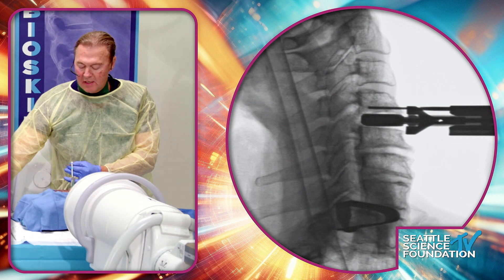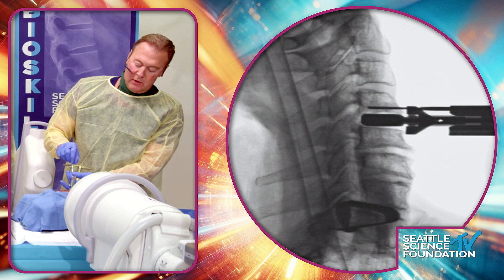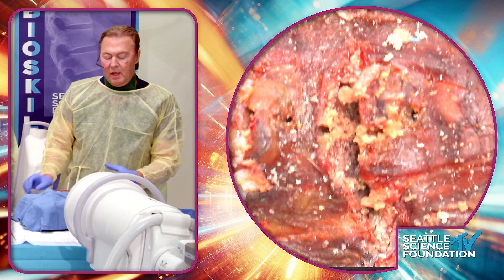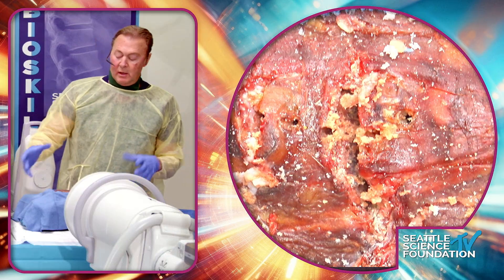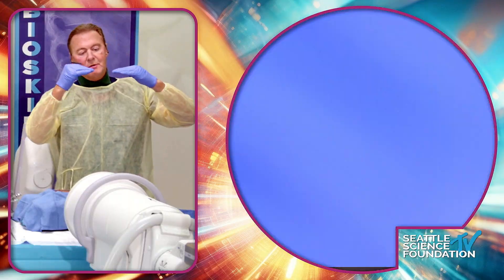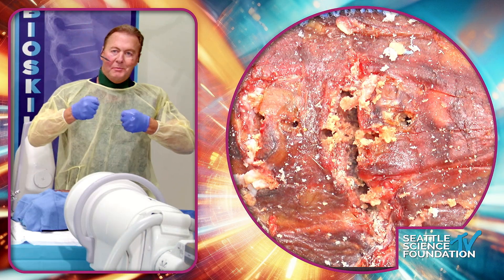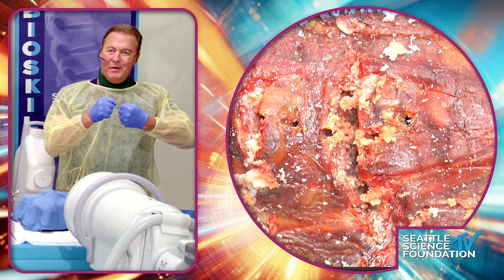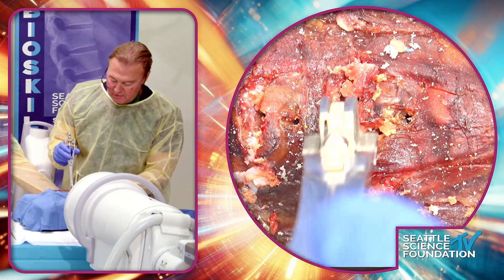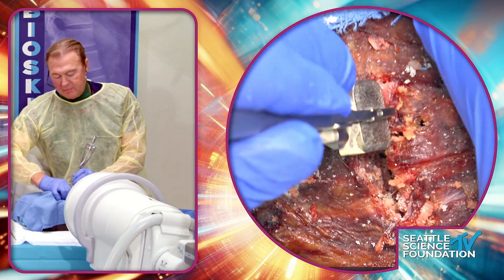I usually put a dull pin on the opposite side before the other drill cut to keep things parallel. I don't use secondary chisels, and I usually have a harness on the patient's head — anesthesia pulls, which opens the space. What I like about that is the space opens naturally based on facet alignment. With Caspar pins you may force malalignment by over-distracting, whereas if you just pull and allow the patient's head to distract naturally, you get a nicer result.